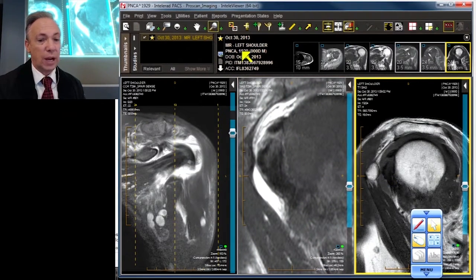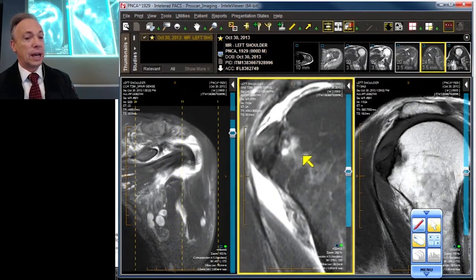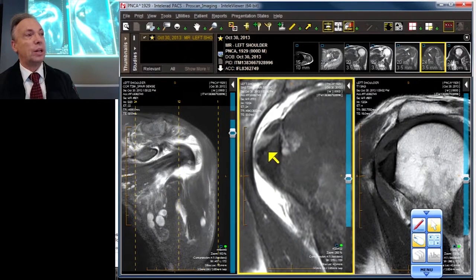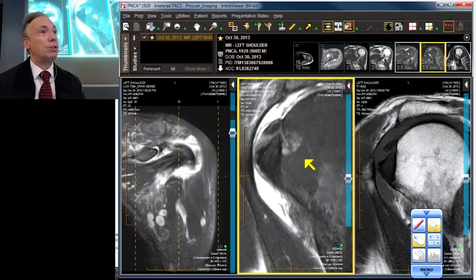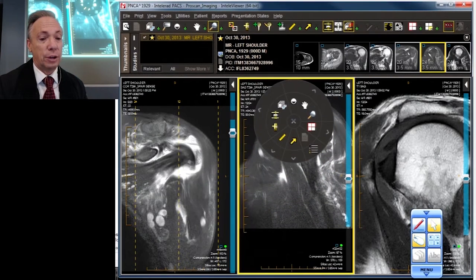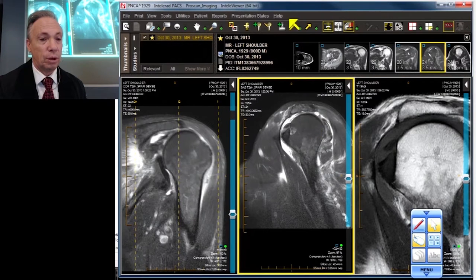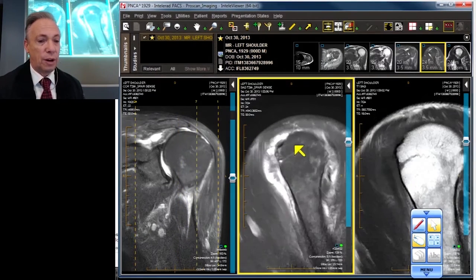The deeper fibers of the subscap — let me blow it up a little bit — these deeper fibers here, which should be flush on the lesser tuberosity, are not. They're replaced by inflammatory fibrous tissue and/or scar. You can see directly above it the position of the biceps. We have firmly established that the supraspinatus is ruptured all the way from anterior to posterior.